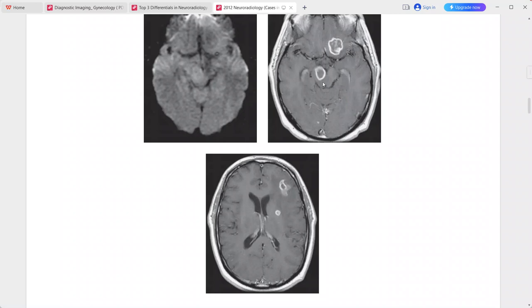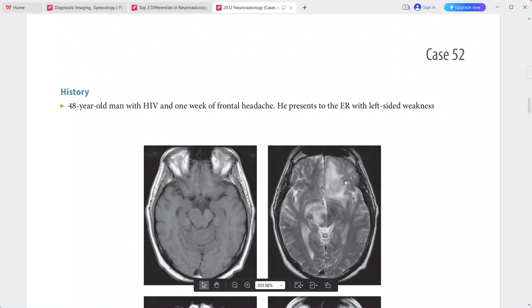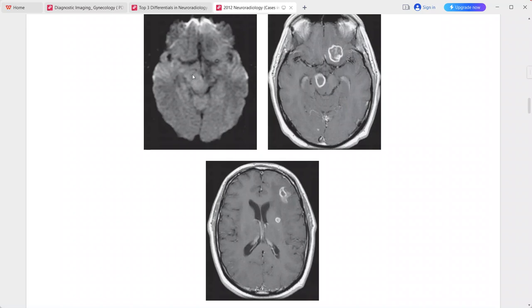T2-weighted MRI shows surrounding edema with heterogeneous internal signal. On DWI the lesions are isointense, indicating no definite restricted diffusion. This is a case of CNS toxoplasmosis.